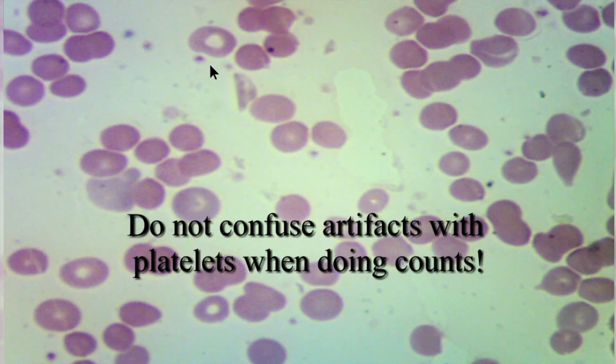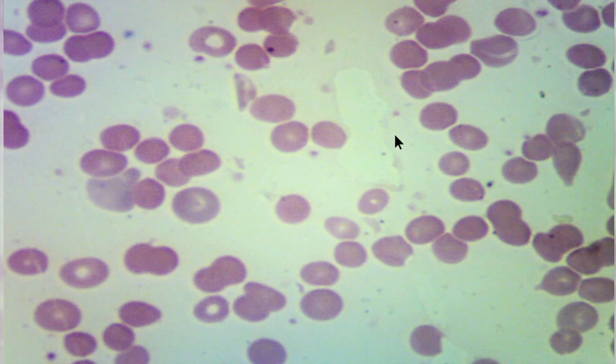There are a lot of artifacts on this slide. These are all artifacts in this area. Platelet, platelet, platelet, platelet, artifact.